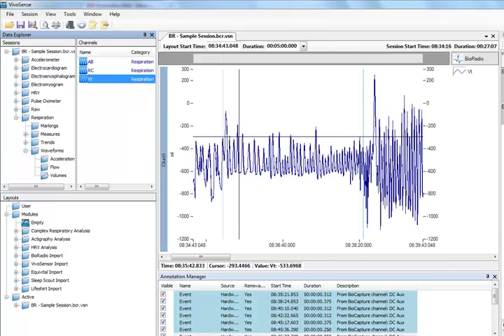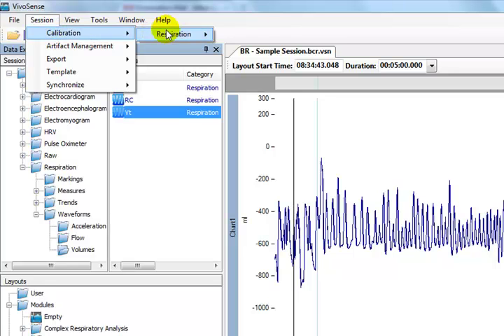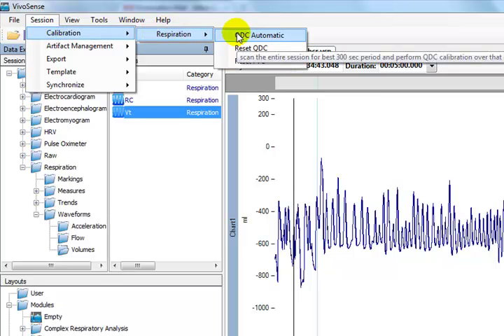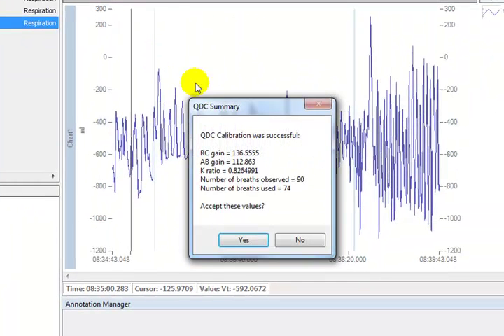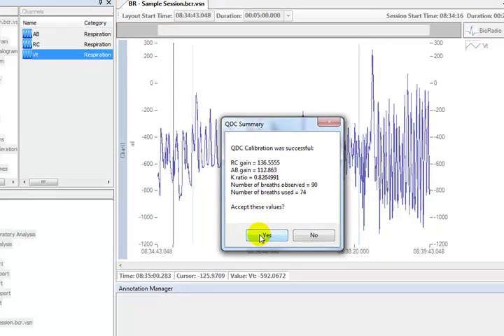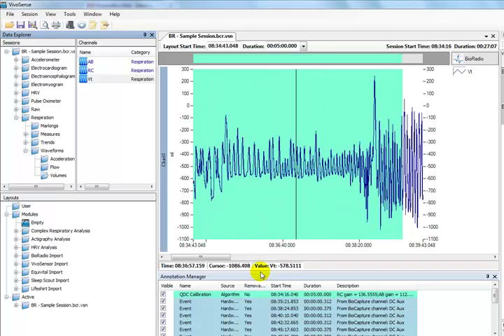In VivoSense, we can automatically determine the most appropriate 5 minute range for a QDC calibration and allow VivoSense to calibrate their compartment volumes appropriately. To do this, we go to the Session menu, Calibration, Respiration, and choose QDC Automatic. VivoSense will scan the waveform to determine the most suitable period of stable respiration over which to apply the calibration. Once the calibration is completed, the QDC summary dialog will appear with details of the calibration, including the K-Ratio. The K-Ratio represents the balance between respiration compartments. Press Yes to accept these values and VivoSense will add an annotation to the Annotation Manager displaying the range over which the QDC was performed.